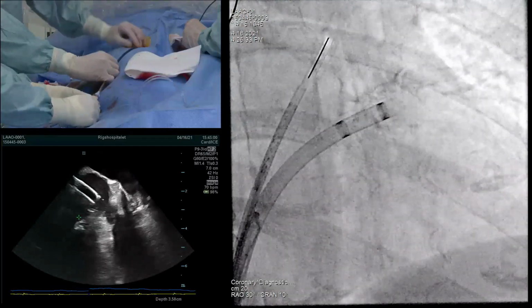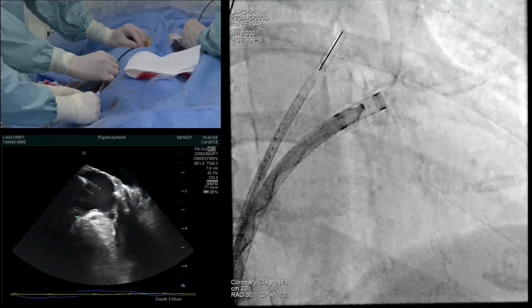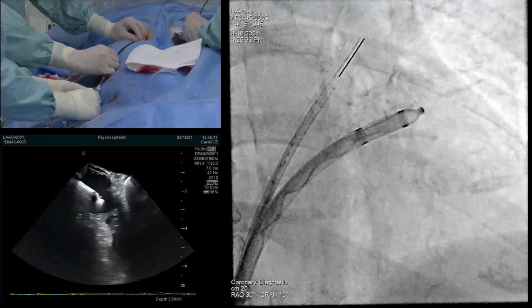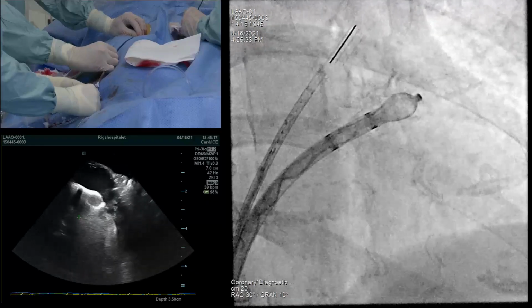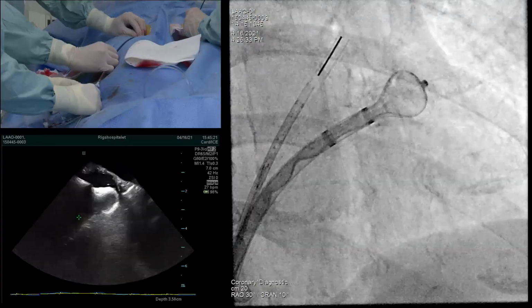And then you see here in a second, now the device is approaching the tip of the sheath. Space to push it. So go out a bit. So Ole, you can comment what your strategy is here. Yeah, so I think we have on ICE, we see we have still depth enough to push the ball out. So this is the first configuration, a ball shape. Yeah, that's enough. Keep it here.